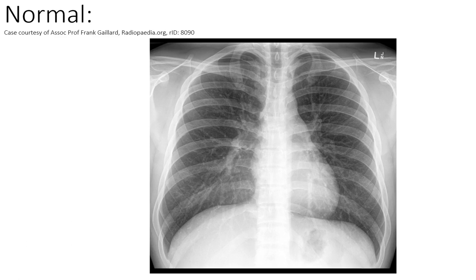You may note that I haven't talked about checking the patient's name and the date on the film itself. This is because with modern imaging, it is automatic in our IT processes that they come up when we order them. Lists of systematic approaches date back to when we had the films on printed copy.